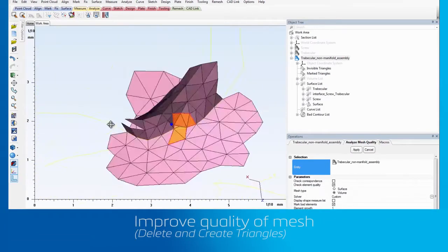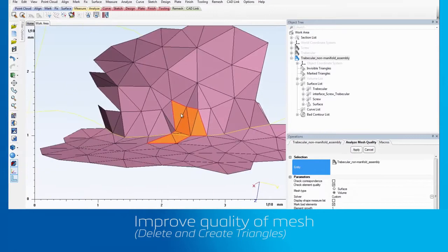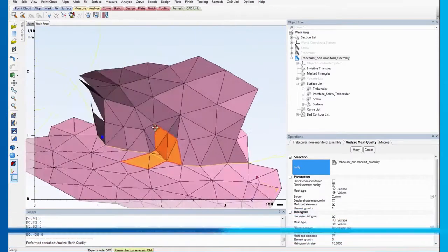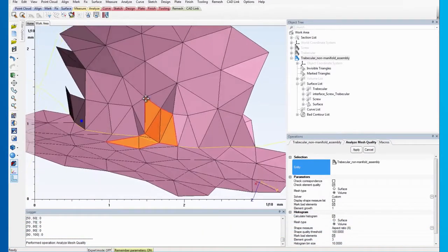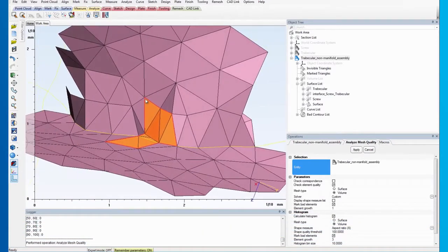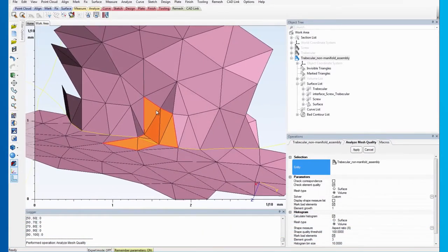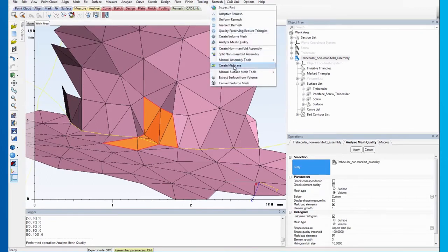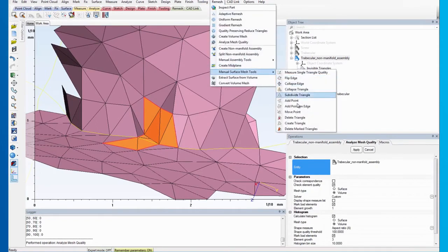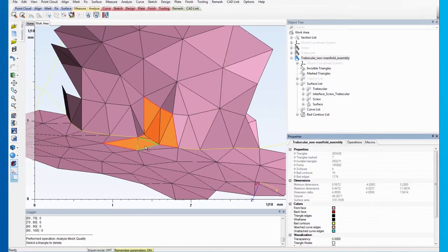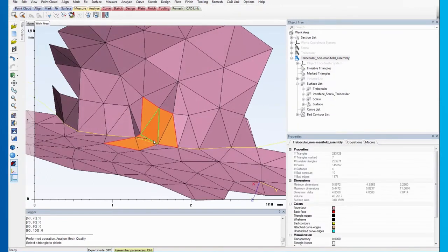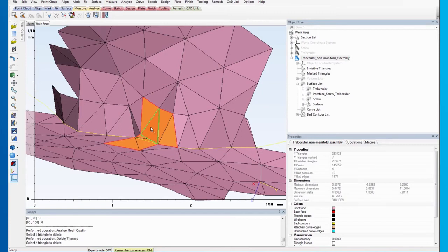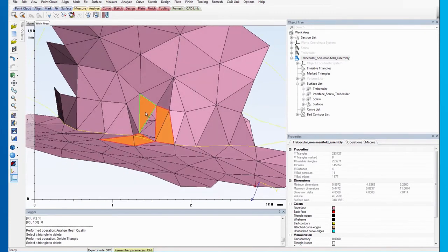Here, you will see that the triangles are marked again. Now, we can proceed with fixing the problematic area. Often, some neighboring triangles will need to be deleted as well, to make sure that the fix is complete.